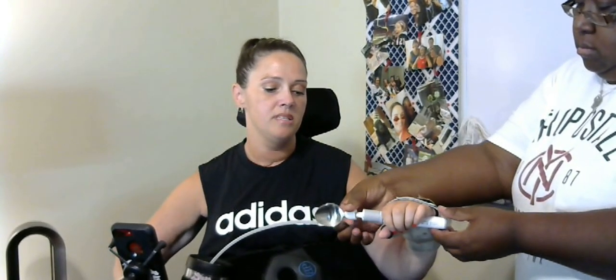And this is my handy assistant Tiffany slash friend slash confidant slash caregiver. And so you see, she just strapped the spoon to the back of my hand. Once you put the spoon part on, it is automatically going to rotate so it's facing straight up. And then as I move, the spoon is always facing up. Even if I turn my arm down, twist it around, whatever shape or form my arm needs to go in, it's going to make sure whatever is on that spoon stays straight up. It works similar to a gyroscope.